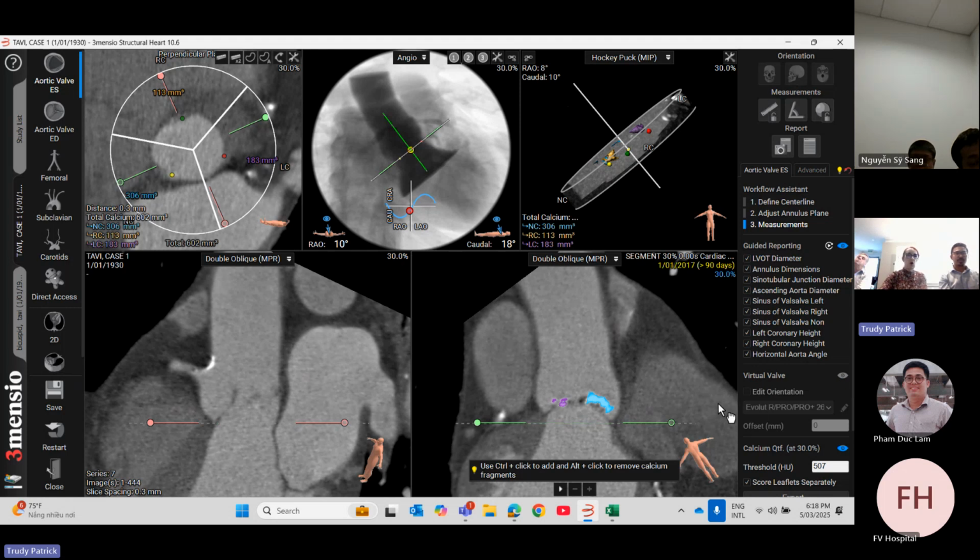Yeah, so that's good. What we can do now, just in the interest of time, because we've got about 10 minutes left, normally we just have a look at the femoral. We do have access for femoral, subclavian and carotid, but they are two specialties all on their own. We can just run through the femoral access quickly, if you're happy with that.